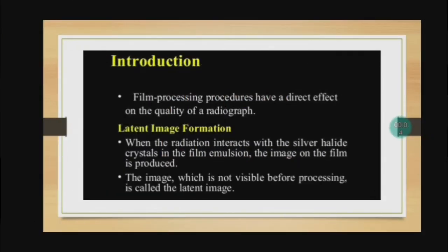Good day. Today, I will be discussing film processing. Introduction. Film processing procedures have a direct effect on the quality of a radiograph.